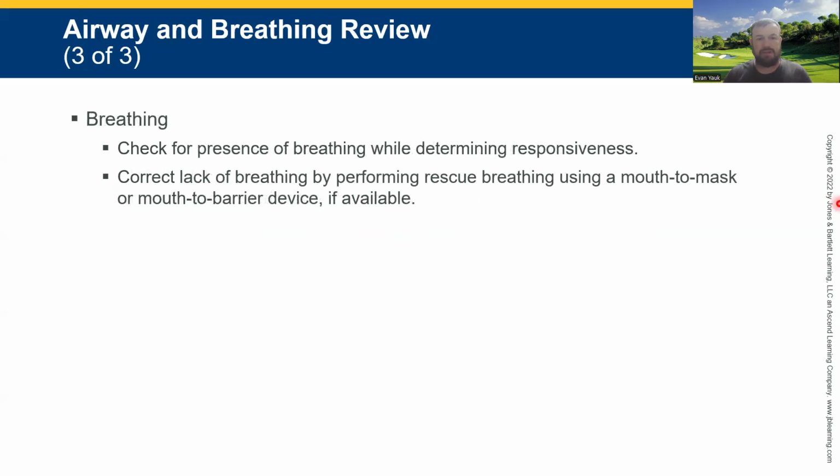Breathing: check the presence of breathing while determining responsiveness. Correct lack of breathing by performing rescue breaths using a mask, mouth to mask, or mouth to barrier device if available.